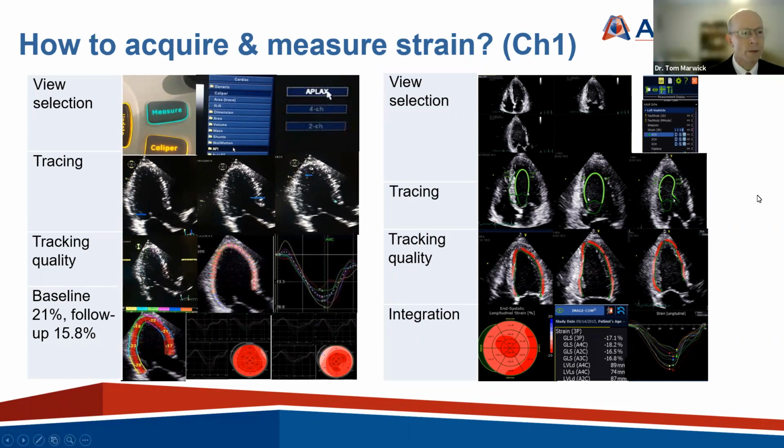Yeah. So I think that is the best model for starting off with strain. I do think that strain on the LV is something that can be incorporated into the routine echo exam. And in a way, it's one of those things that you do a lot of and you get good at. So I'm certainly a fan of that, but it is really helpful to have some people that are very expert in the sonography team just to help troubleshoot.